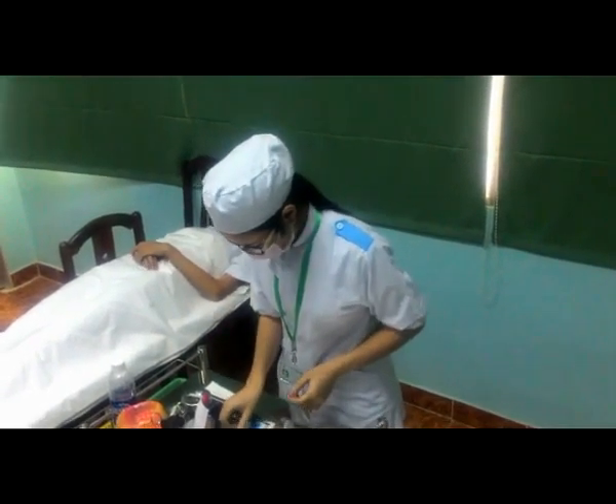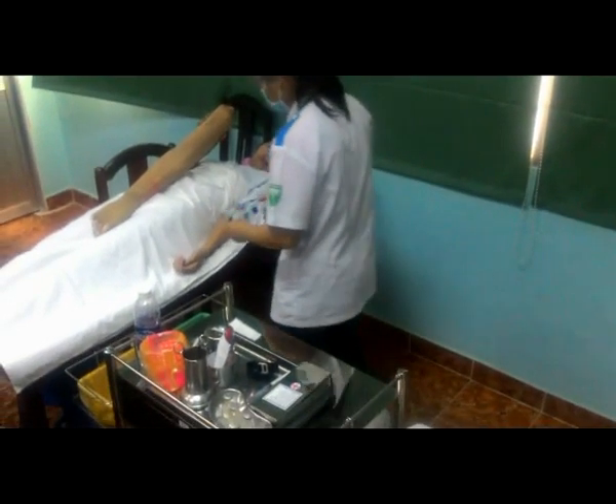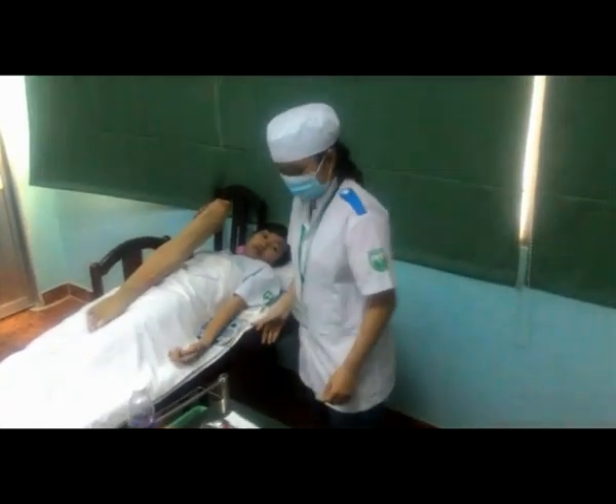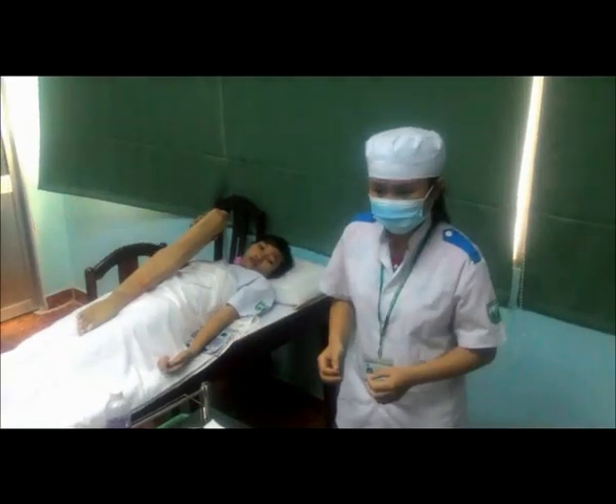Chuẩn bị tư thế bệnh nhân, bộc lộ vị trí tiêm. Lót tấm vải láng phía dưới. Chọn tĩnh mạch to, rõ, thẳng, ít di động.